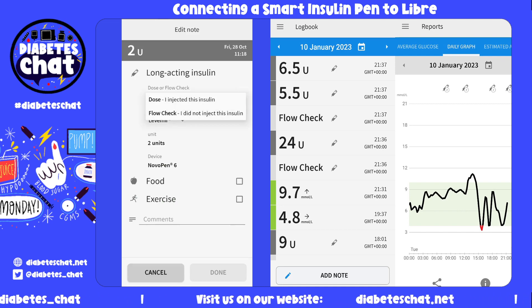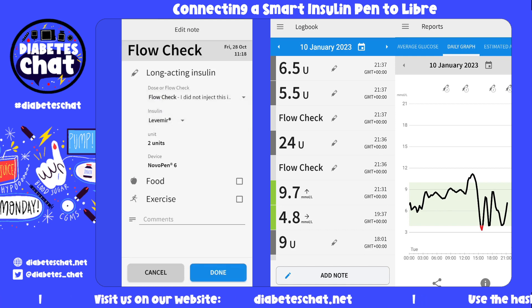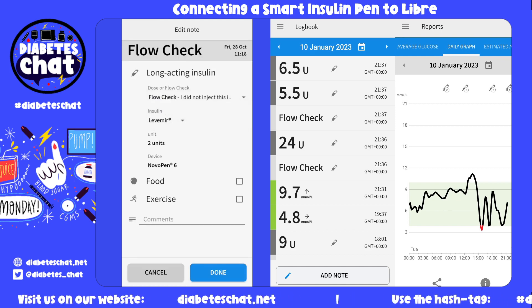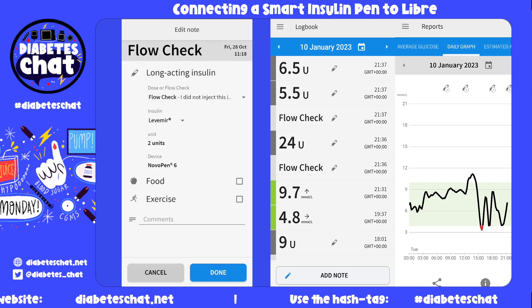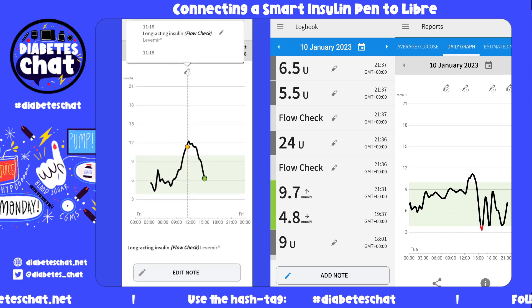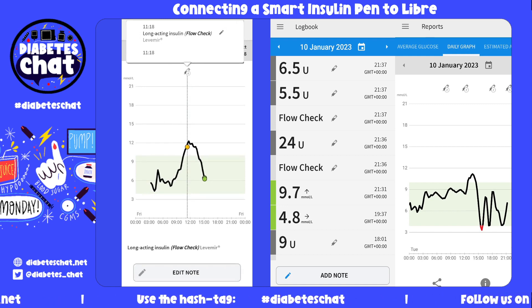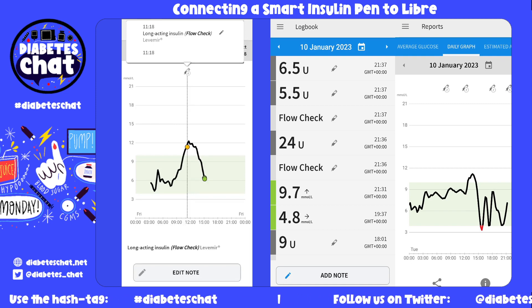It was a flow check — I didn't actually give that insulin to myself. You can also add more notes there if you wish to: food, exercise, or comments. So there you can see at 11:18 I gave myself a two-unit air shot.